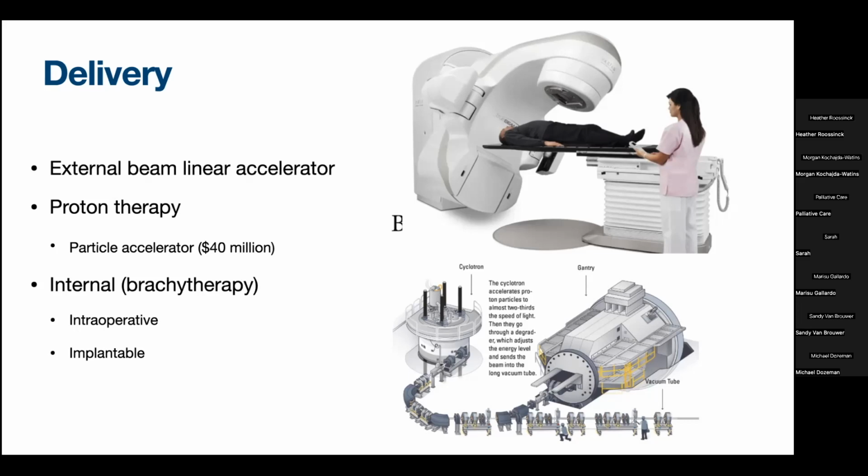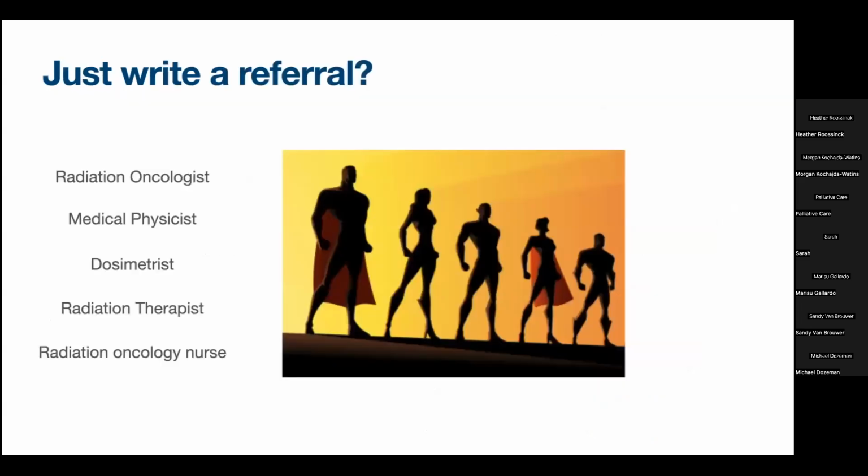it's still being researched. And then there's internal therapy or brachytherapy, which can be an intraoperative administration or sometimes implantable, especially those in the pelvic cancers and the GYN and GU applications.